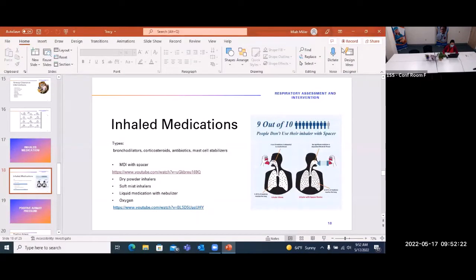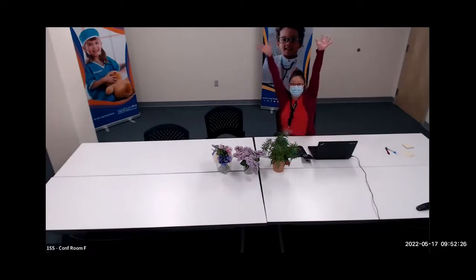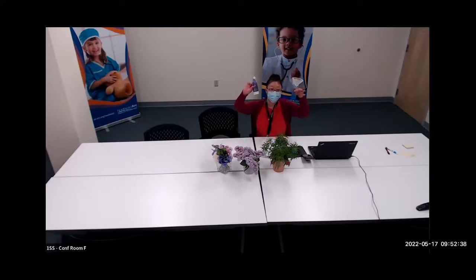Okay, I just want to show you something for a second. I'm going to put myself back on the big screen. So I think you can see me. And I just want to mention something about the AeroChambers. So I hope that your clients are able to get at least 2 spacers and at least 2 inhalers of their medication. So hopefully they have at least 2 albuterol at home, 2 rescue inhalers, and they have multiple spacers at home, because I'm going to tell you why.